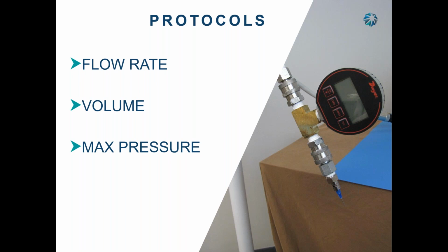Why is there a difference? Right, they don't care about dilution rate. They want that contrast going in there.